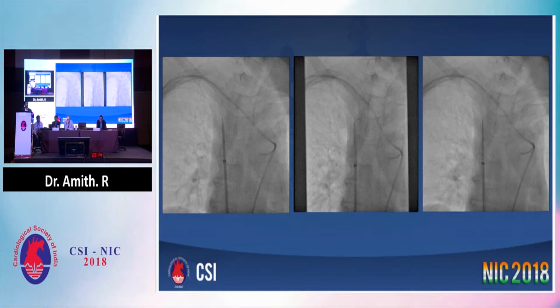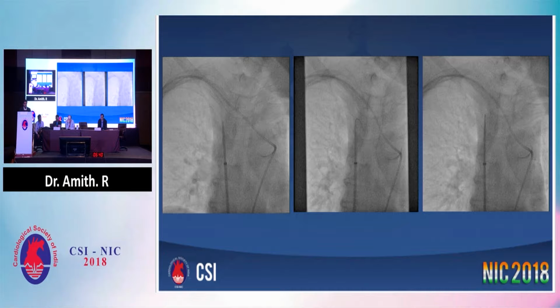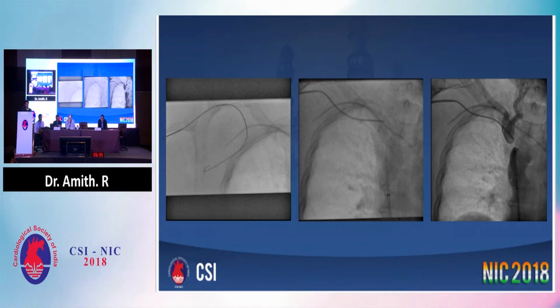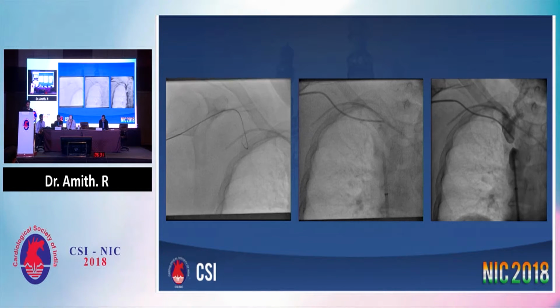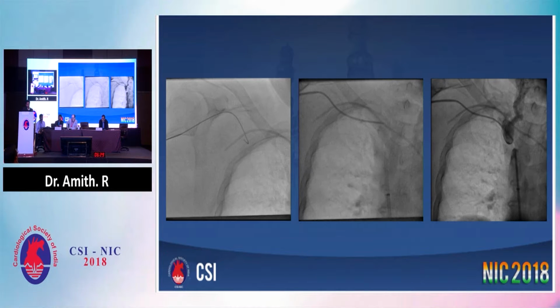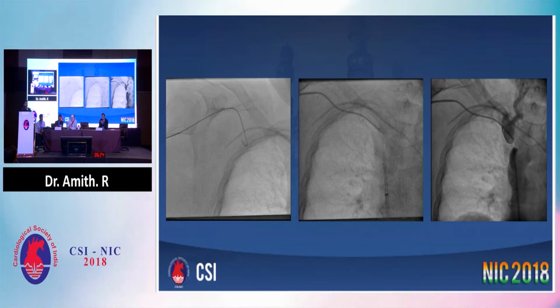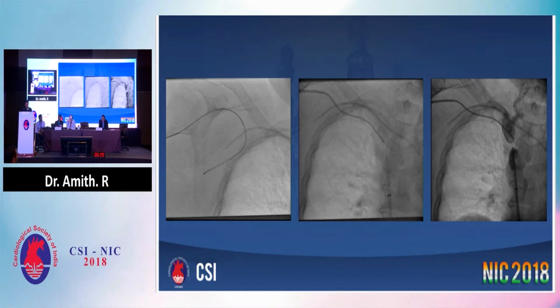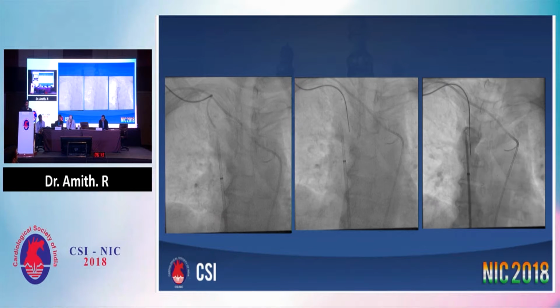So then we decided to go through the antegrade approach through the right cephalic and the subclavian vein. In this we can observe that after the guide wire we pass the multipurpose catheter again, and the simultaneous injection from both the ends revealed that there was a short segment complete occlusion of the right subclavian vein. Next, our plan was to introduce the Terumo wire through the subclavian vein catheter and snare it down from below. Now these are the videos showing the same.